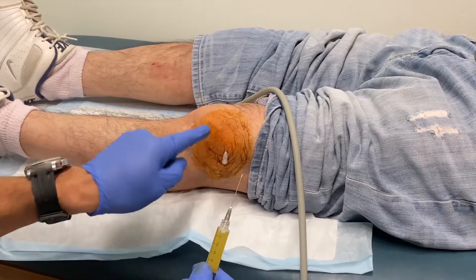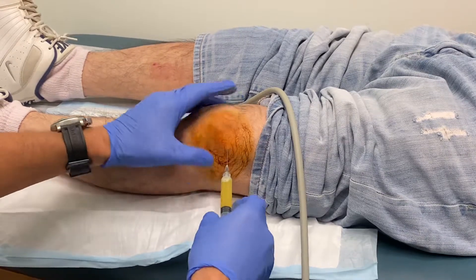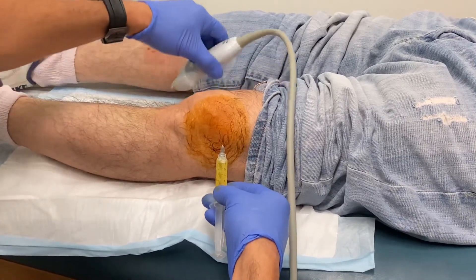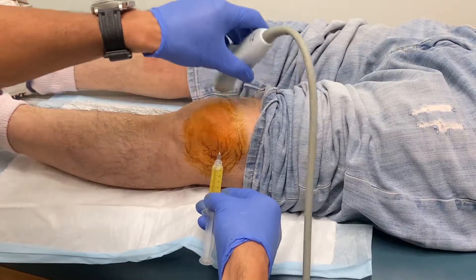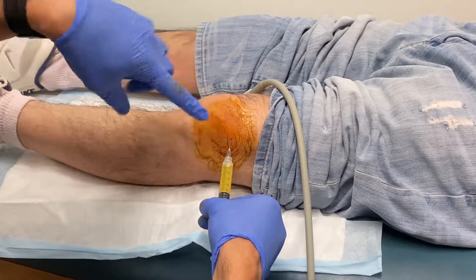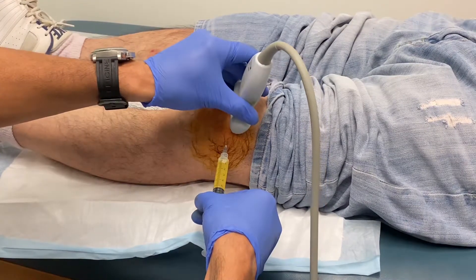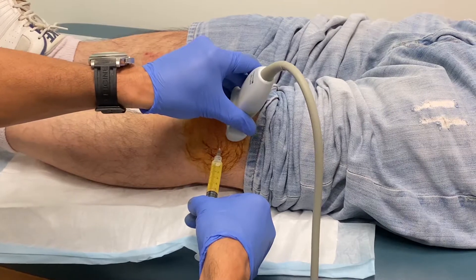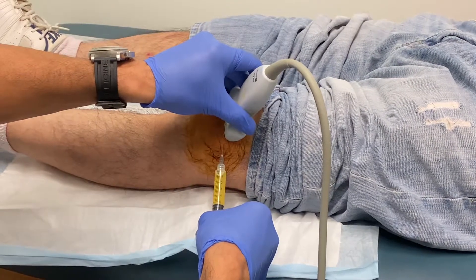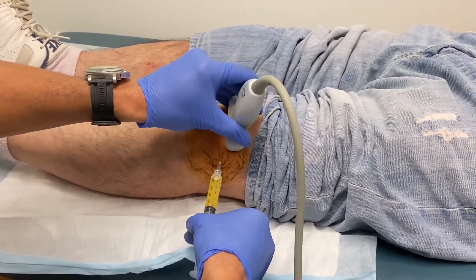So what I do now is I observe the trajectory of the 27-gauge needle, remove it, and keep my eye on the ball. Now that felt like it's in the joint — I can tell by feeling the resistance. So what I do is use my ultrasound to confirm. I'll keep the video over here; I'm not going to show the ultrasound for the sake of privacy because there is a name on there. I'm using my ultrasound probe — there it is. I see my needle in the joint. I'm going to change the location just a wee bit here to make sure I'm 110% certain.